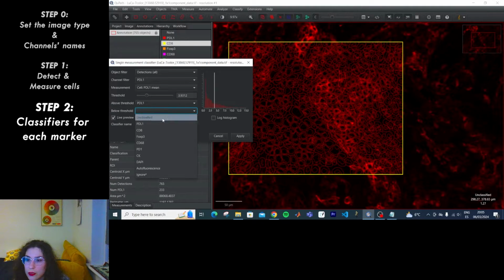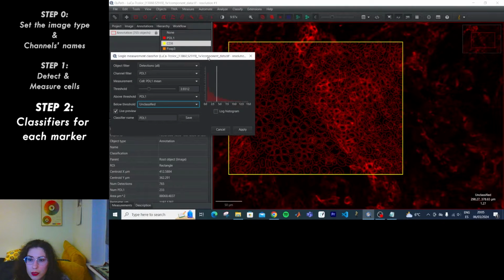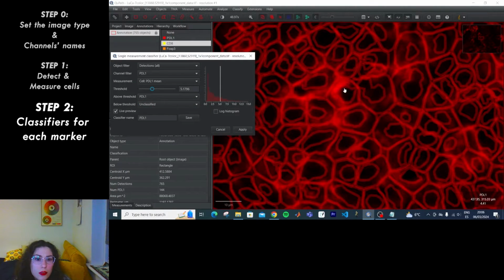Below threshold, unclassified. Was that the problem? That I needed 2 things? Nope. Wait, what is this? 28. 28? Because I'm using a mean.